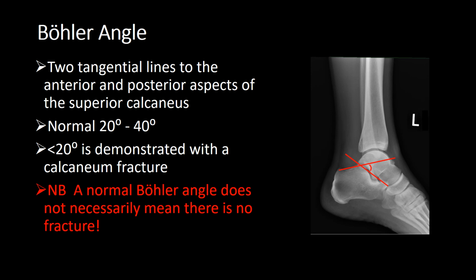I really don't like the Bohler angle. I will teach it to you because it's pretty much in every single textbook, but I'll explain to you afterwards why I have a pretty low opinion of this aid to assess image interpretation.